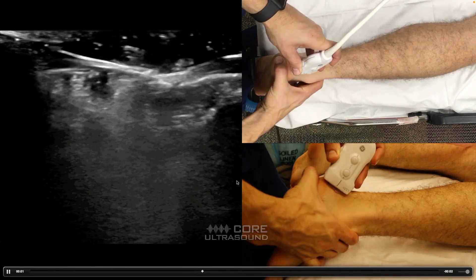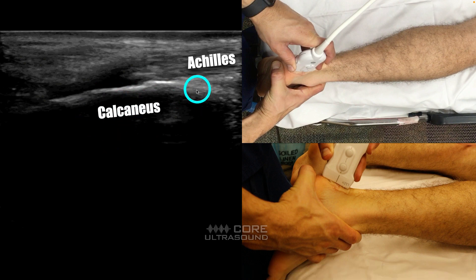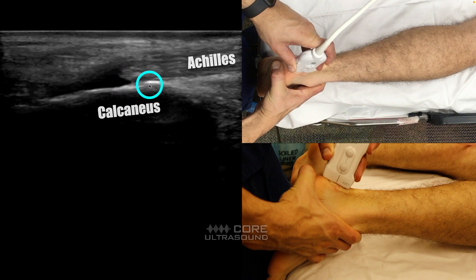So here is what that looks like. You can see I'm dorsiflexing, and we have our first structure here — the calcaneus — and we have our Achilles over here. Notice it's a little bit dark, a little hypoechoic. This is actually due to anisotropy as the tendon comes in and curves to attach to the calcaneus. No actual pathology here, although sometimes there's a little bit of a bursa that you can see, and that might be what we're seeing right there.